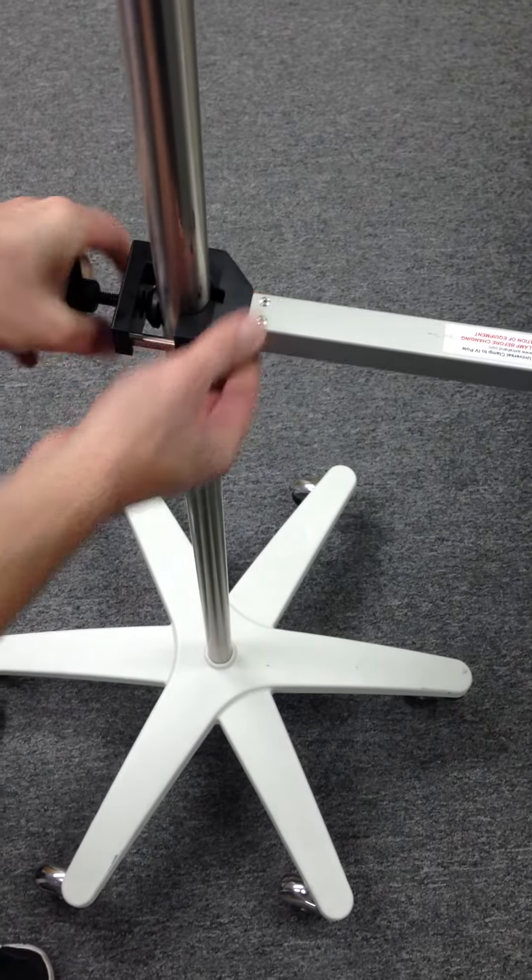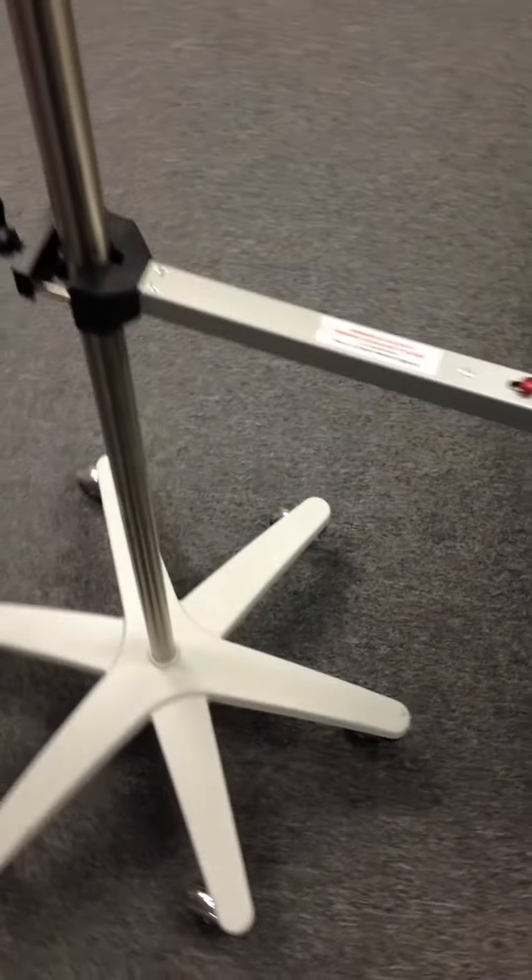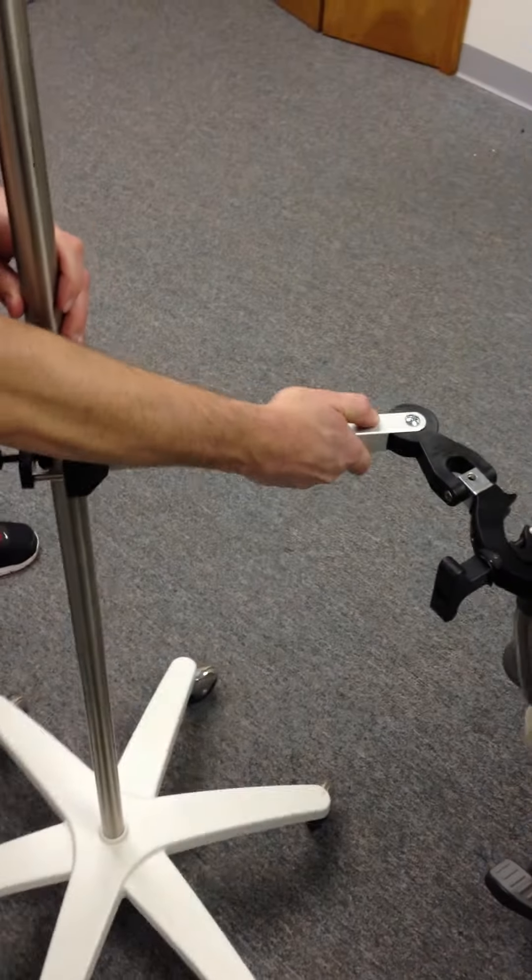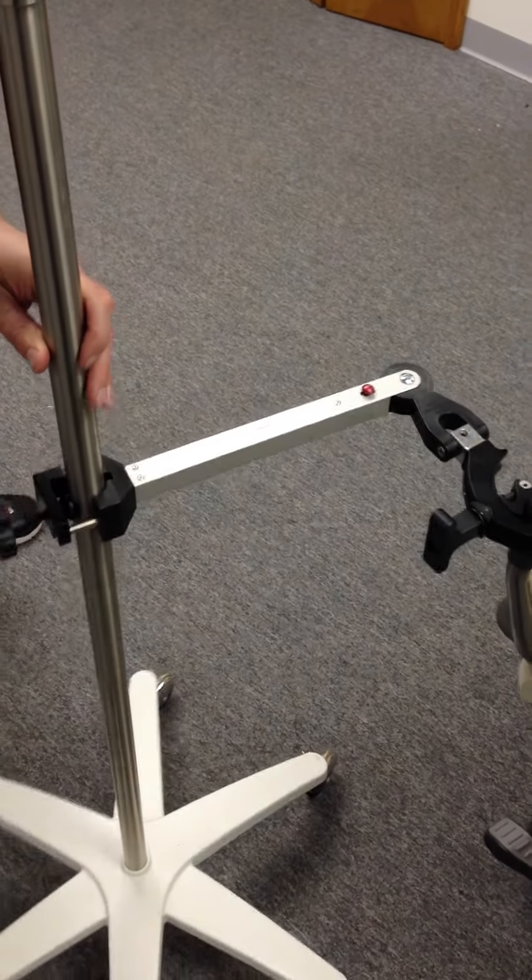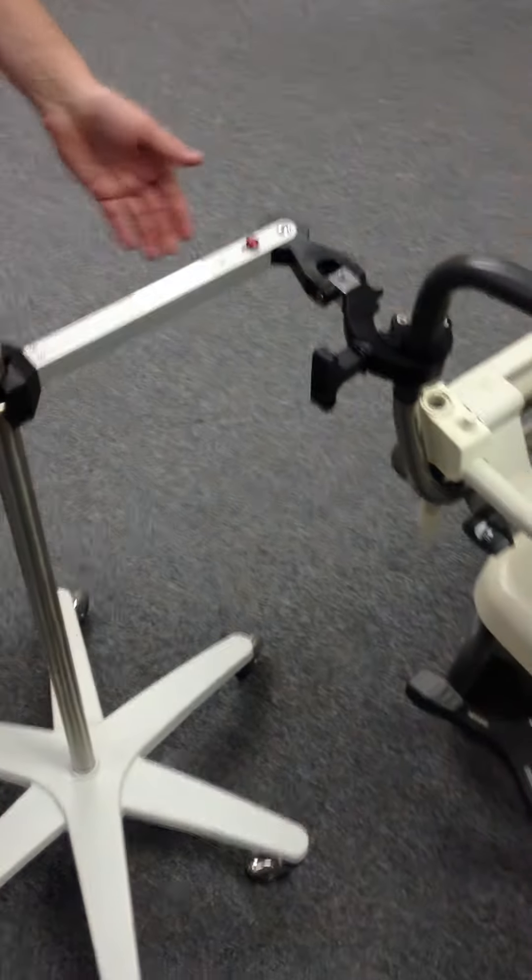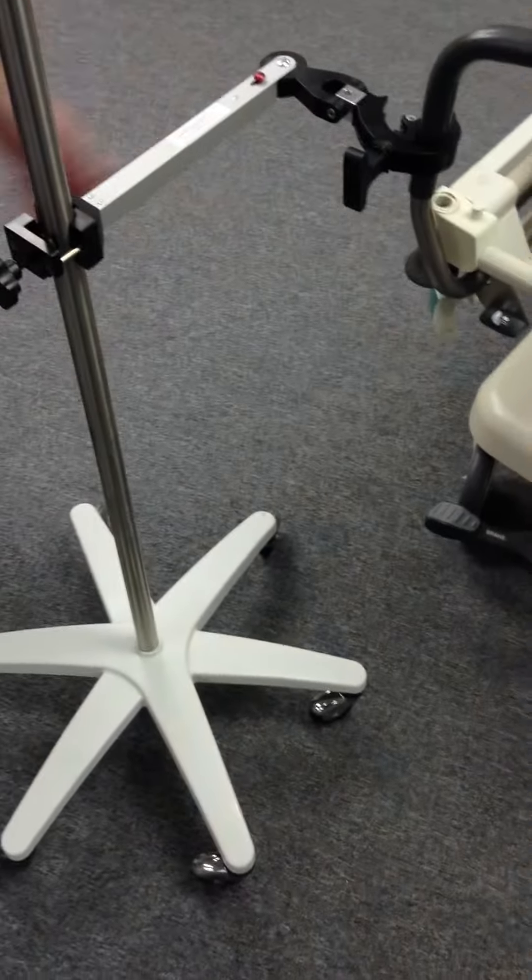Now the pole is attached to the bed. Then you can simply adjust it however you want and you can move the patient.